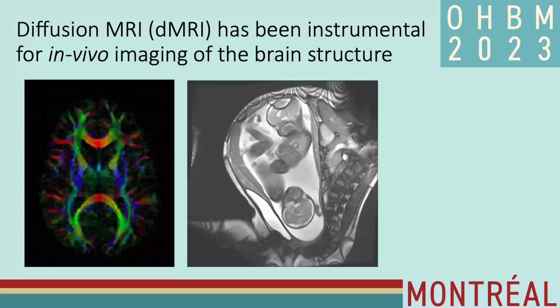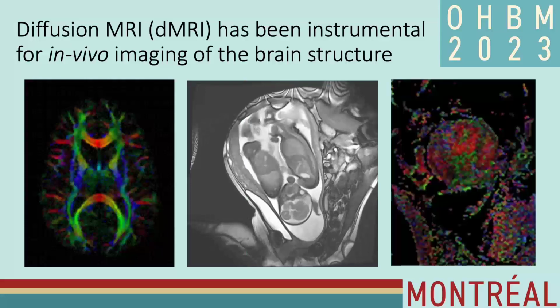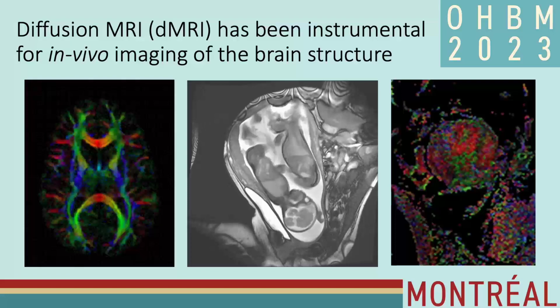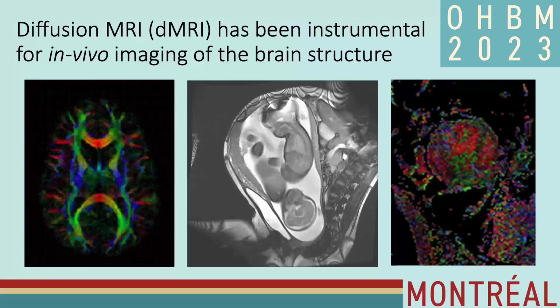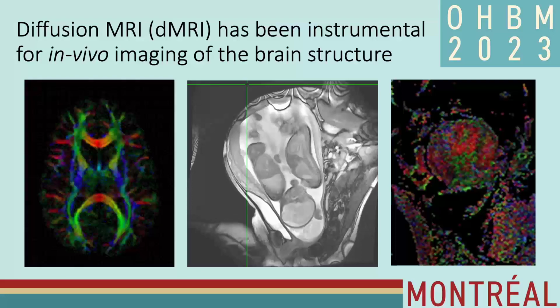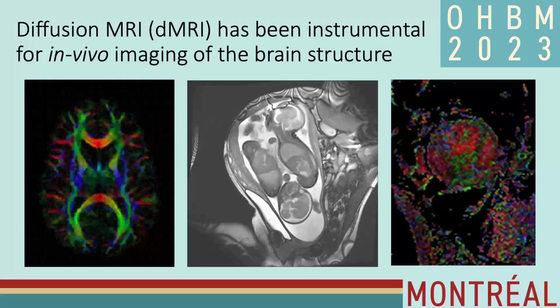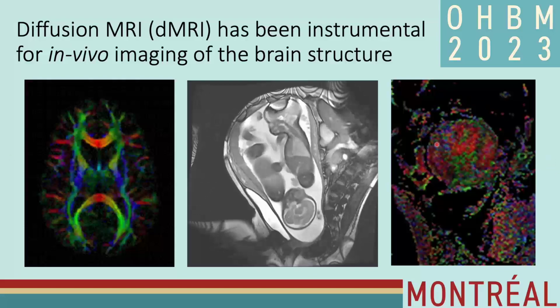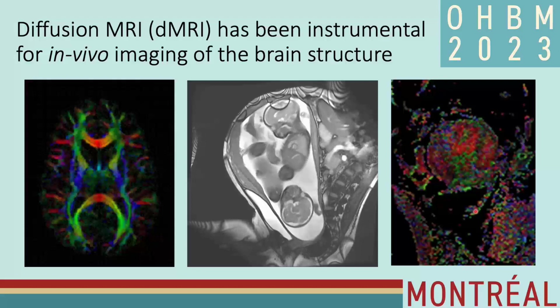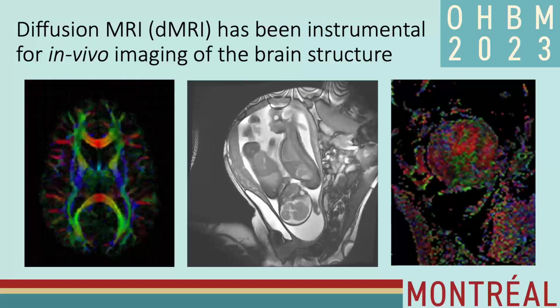My goal in this presentation is to explain the research that we undertook in the past years to address the challenges inherent in fetal DMRI and show where we stand in terms of tools and resources that are available to study early development of the brain and the brain connectivity. Here in this image on the right, you see a color fractional anisotropy that we tried to get out of the scanner without any processing. And you see how distorted it is.